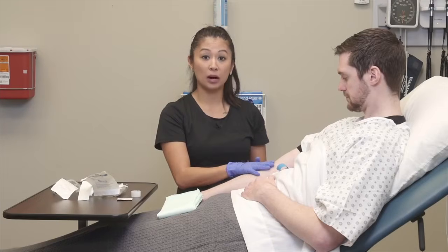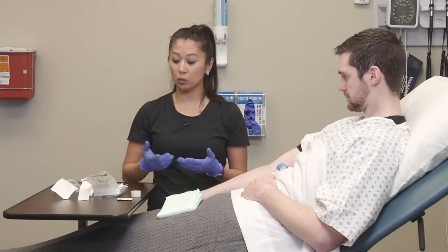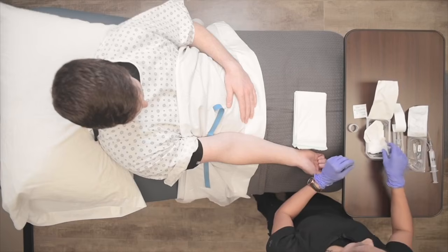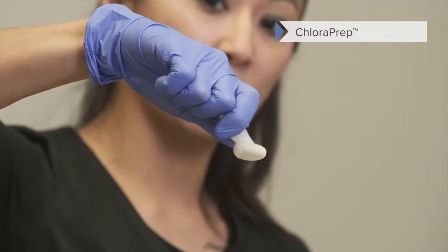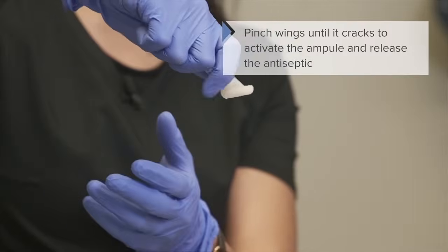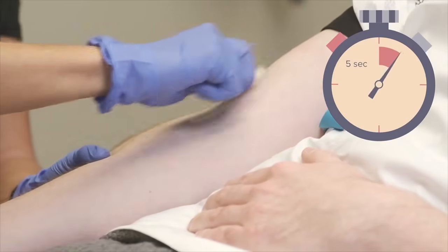And now that I know where I want to go, I'm going to take my cleaner and make sure this is clean for insertion. So depending on your IV start kit, you have options. So this particular kit has what we call ChloraPrep, pretty handy little guy here. So we're going to point this down and we're going to crack this, and you usually can hear it. Hear that nice little crunch, very satisfying. So we're going to make sure this is feeding the pad, and we're going to really scrub this in a motion for at least 30 seconds.